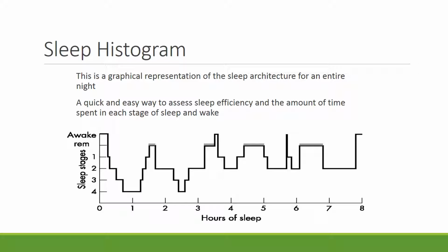So just like we had talked about before, the last half of the night, they're going to have less stage N3 and more REM, and you can see that's what's happened here. After the first 4 hours of the night, they don't go back into stage N3 sleep.